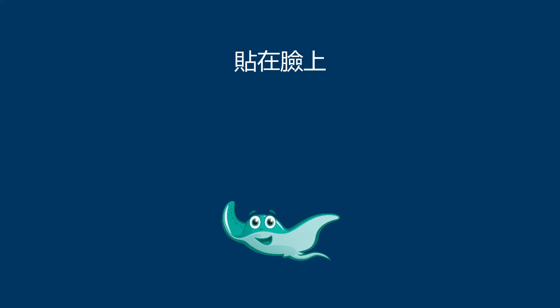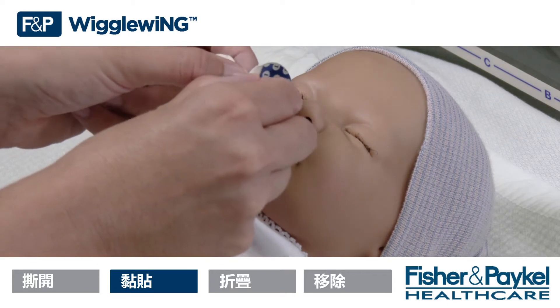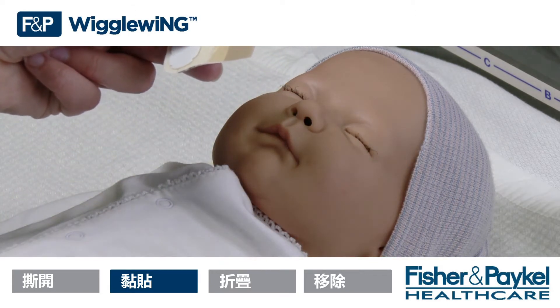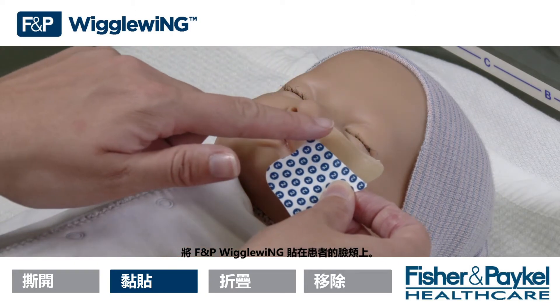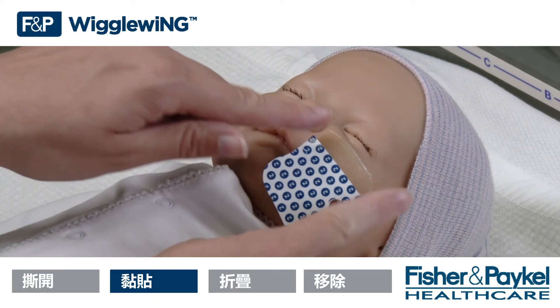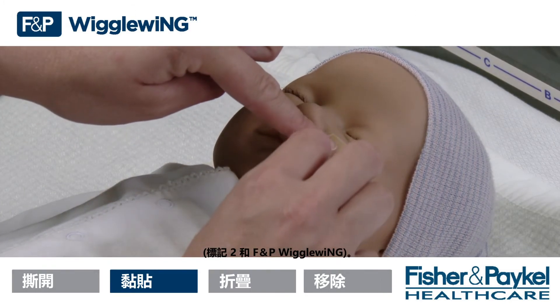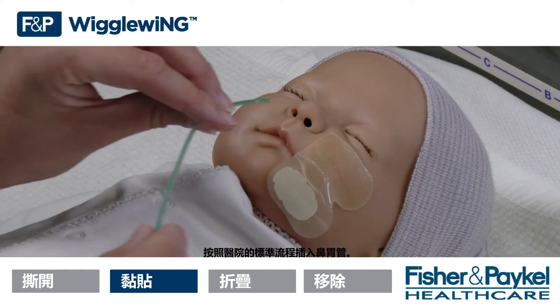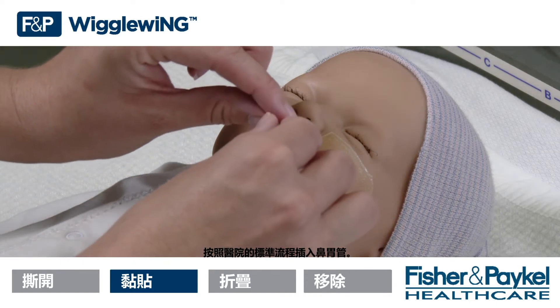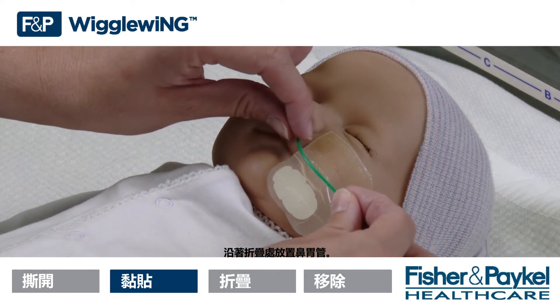Stick to face. Peel off the blue tab marked 1. Stick the FMP Wiggle Wing to the patient's cheek. Peel off the white tabs marked 2 from the FMP Wiggle Wing. Insert the NG tube according to hospital protocol. Place the NG tube along the perforations.